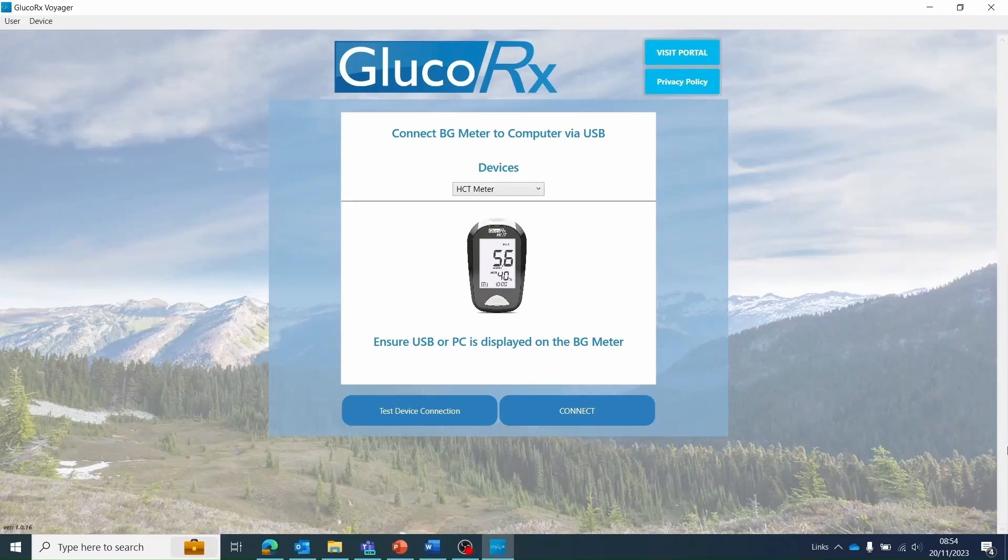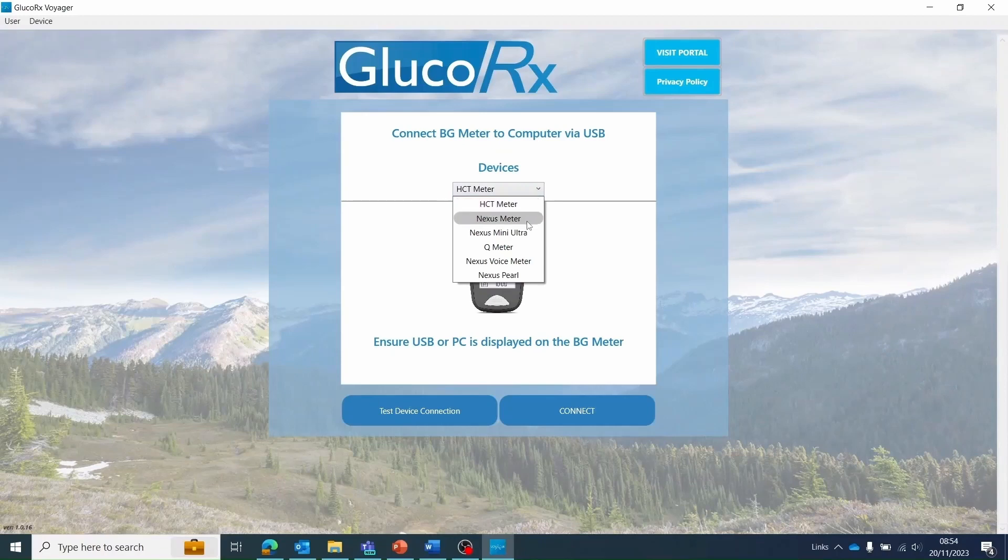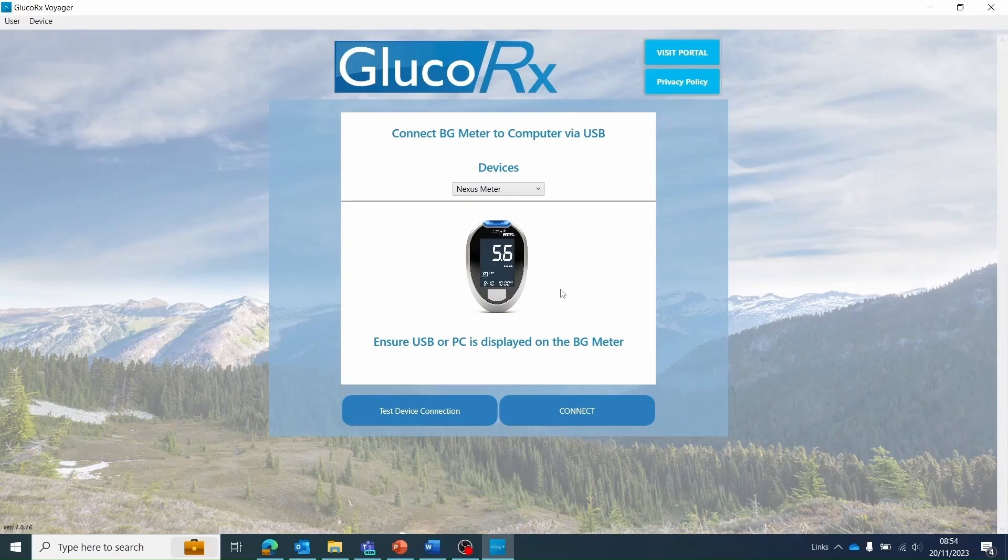You will need to select which GlucoRx device you wish to upload readings from. You can do this by using the drop down menu shown. I'm demonstrating using a GlucoRx Nexus meter. Once you have chosen your device, you're ready to connect it to your computer.